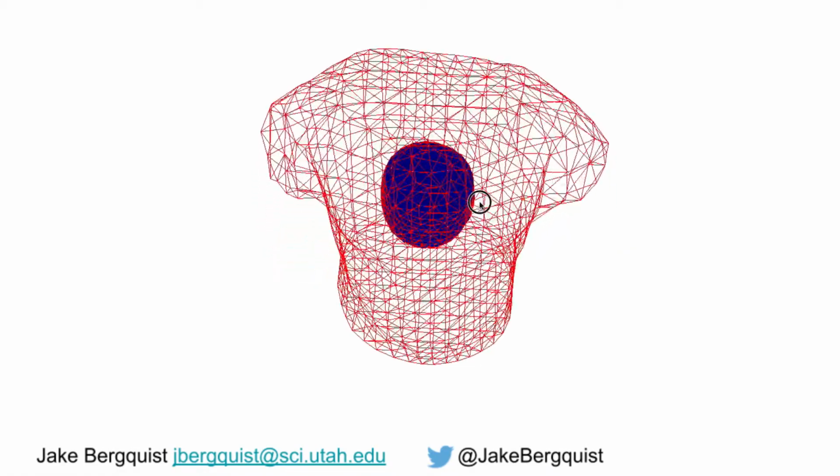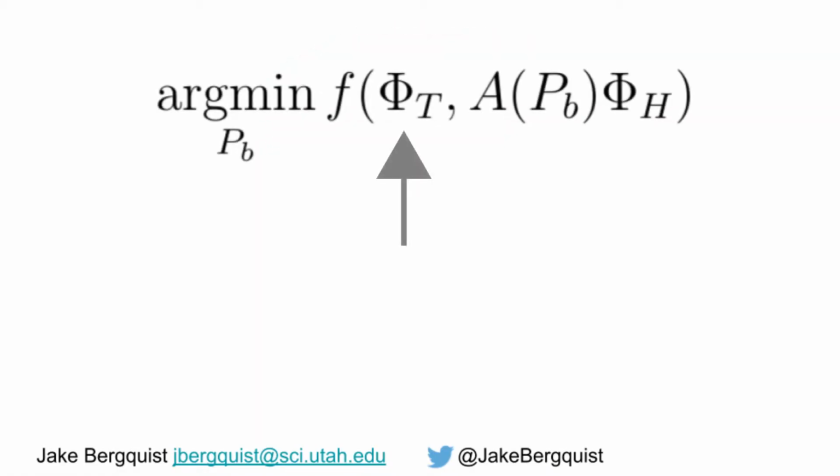The method developed previously relied on having access to both body surface recordings and recordings of the cardiac source itself in order to perform this forward-based optimization.